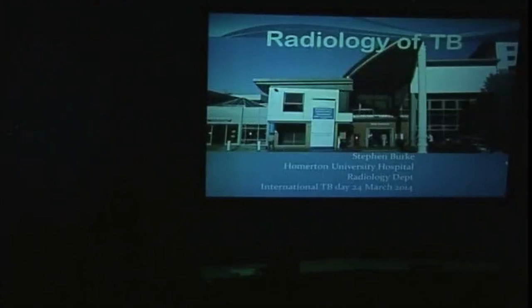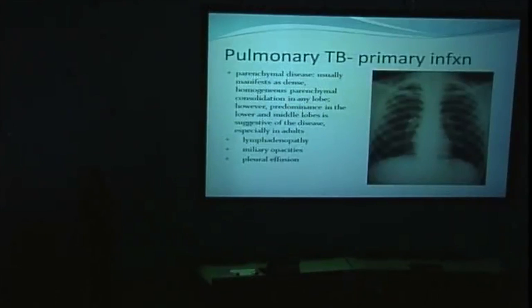Well, obviously, radiology of TB is a huge subject, but I'll just try and give you some ideas about the sort of likely patterns we can expect and useful investigations, hopefully.